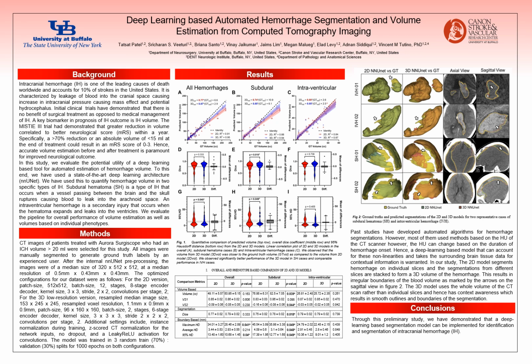Studies have shown that in the past, a 70% reduction of hemorrhage volume from before surgery to after surgery could result in an improvement in neurological outcome, which is quantified through the modified Rankin scale, or if the final volume after the treatment is less than 15 ml. But if you use crude methods, which rely on manual segmentation and manual measurements, you may or may not end up with accurate volume estimations.